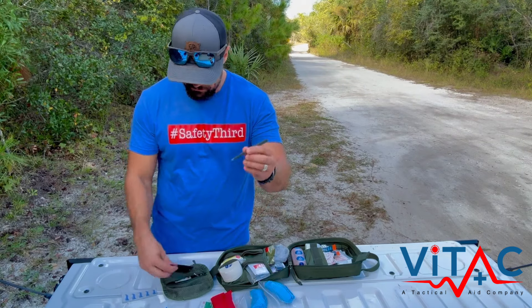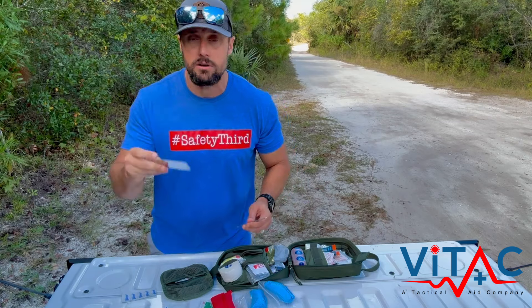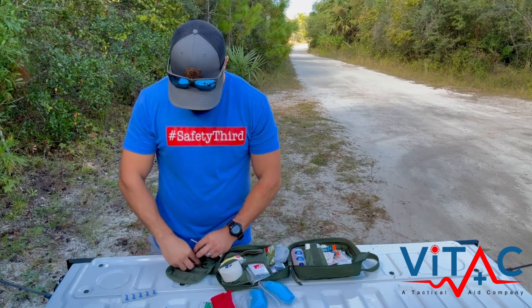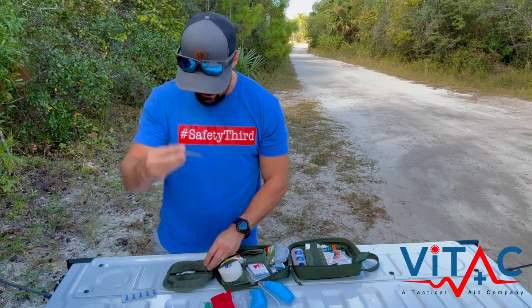You've got some tweezers and a little mirror. This mirror isn't just for signaling — though you can use it for that — it's great to see if you've got something in your eye or if you have a gash on your face. Tweezers are of course for pulling stuff out, like splinters and things like that.